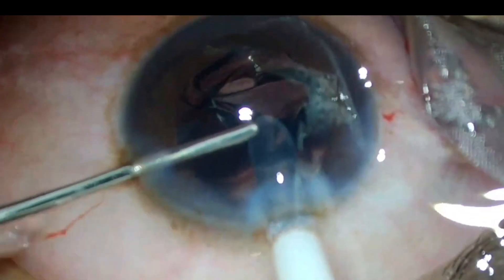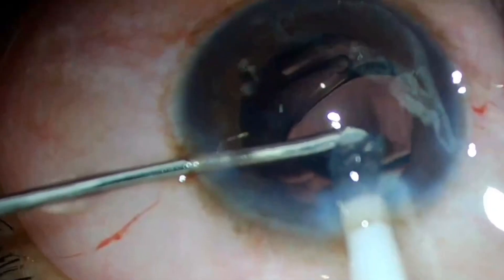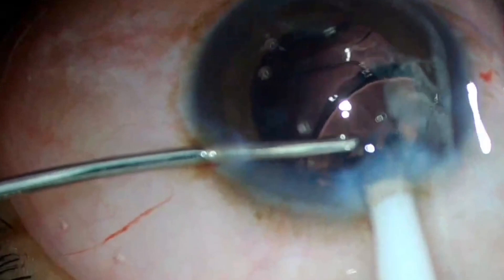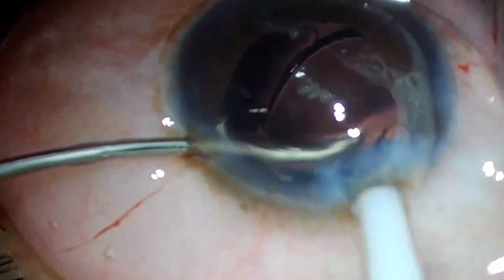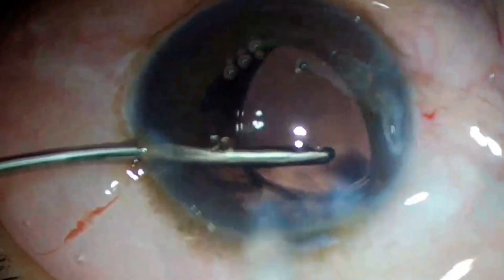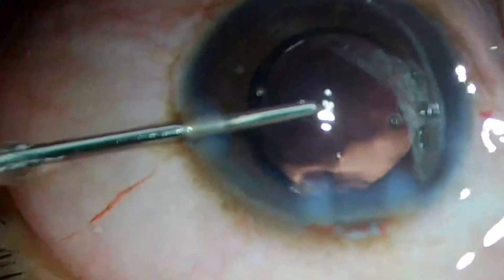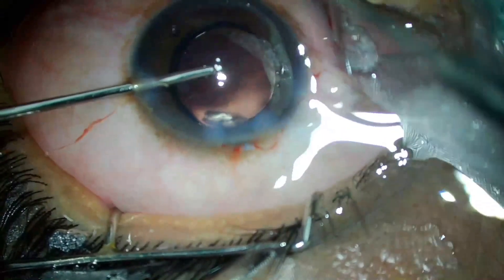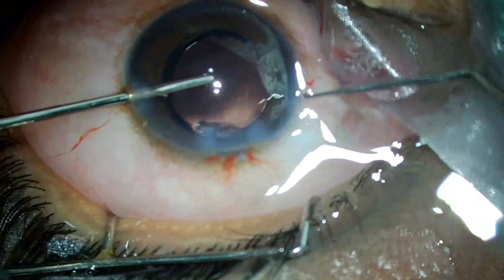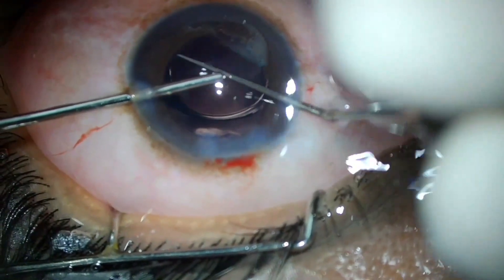Slow release of the IOL is recommended and progression of IOL insertion must be monitored keenly. Keep the irrigation cannula above the IOL and watch the unfolding of the leading haptic, making sure it goes below the iris margin into the bag. One can rotate the injector according to the unfolding of the IOL so it opens in an S-shape and does not get tangled. The trailing haptic can then be pushed into the bag and dialed to position.